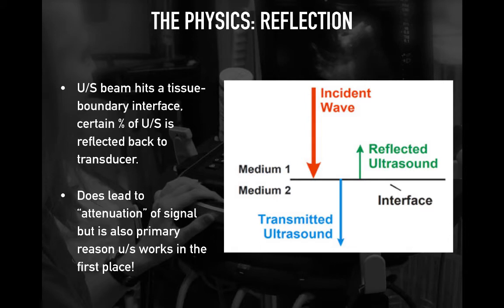The magnitude of the reflected wave depends on the tissue acoustic impedance. The reflection is greatest at interfaces with huge differences in impedance, like tissue and air. The tissue-air interface generates an intense reflection as air has a much lower impedance than tissue. As a consequence, ultrasound cannot penetrate air-filled structures, such as bowel or alveoli, but you can identify structures around it. In contrast, ultrasound waves can propagate through fluid-filled cavities with no reflection and no attenuation.